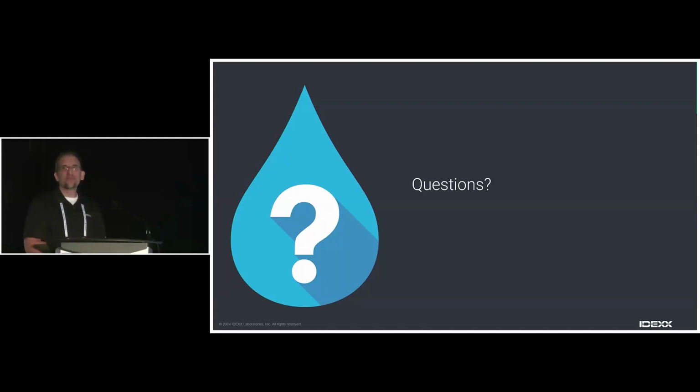I had a question, and then you answered it right at the end there. I was curious about maintenance frequency. Yeah, so the optical validation should be done on a monthly basis, but there are other things that can be done, and I'm not getting into that part of it, but there are service plans that can be worked with as well.